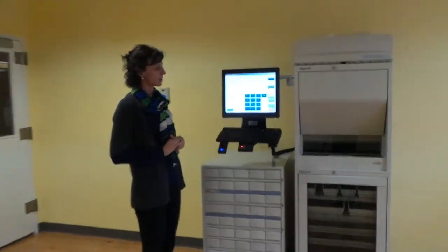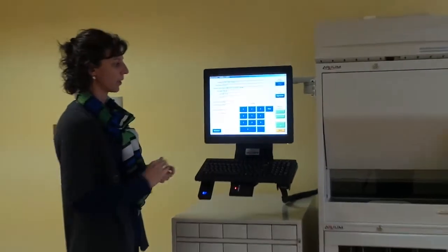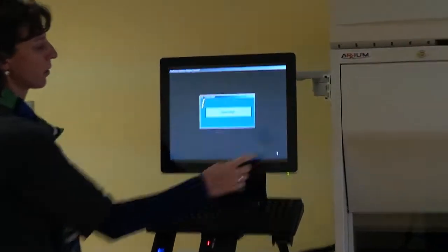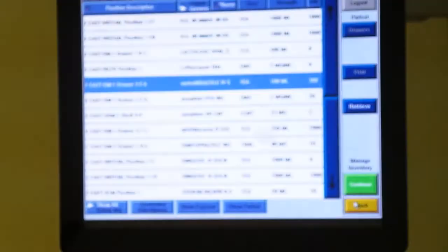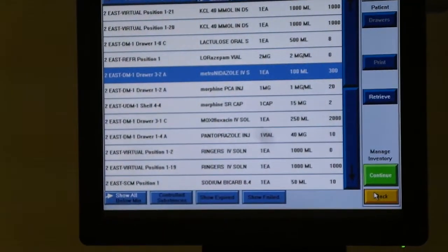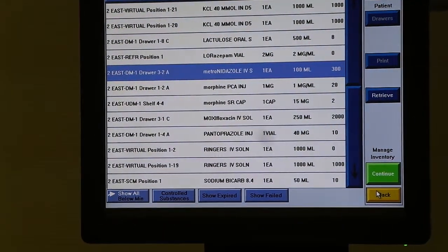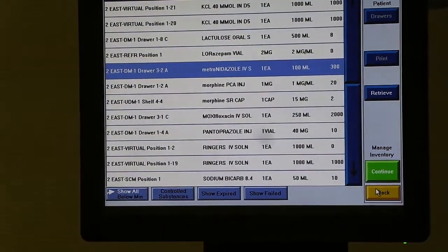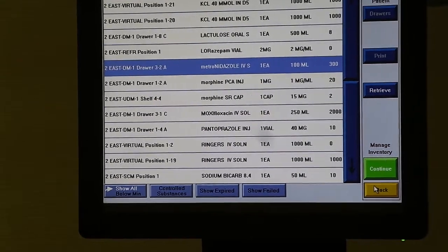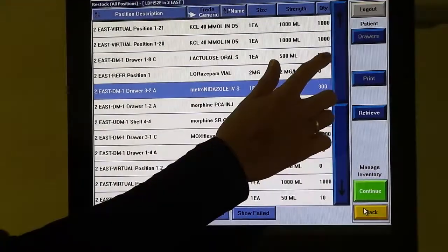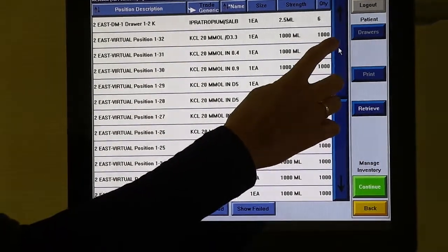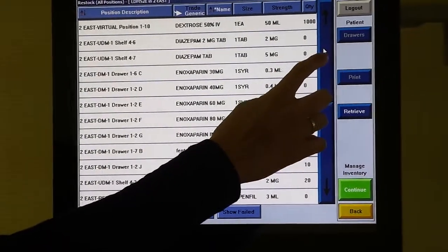The next piece of hardware that I'm going to refer to is the unit dose module. Only 2East and the emergency department have a unit dose module. This is also for dispensing narcotics and controlled substances.